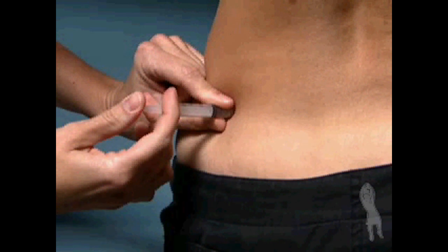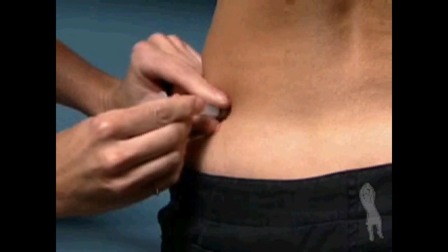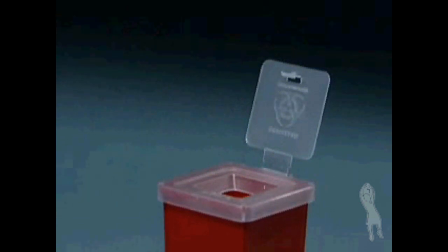This does not happen very often and is not a reason for concern. Once the injection is completed, gently withdraw the needle and apply pressure to the injection site with a sterile gauze pad. Discard the used syringe and needle in your safety container.